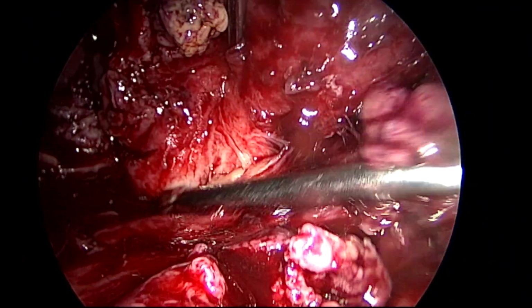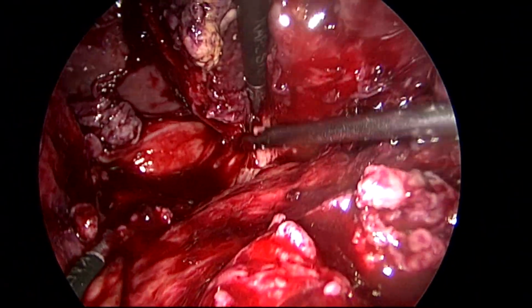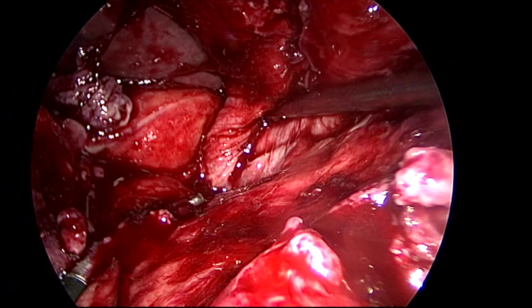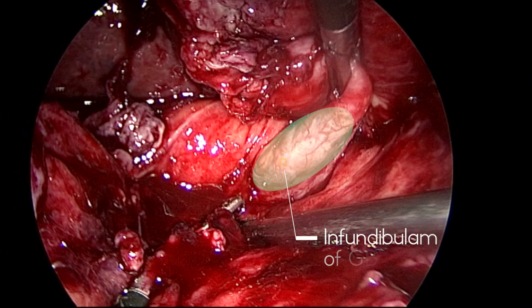Once I identify the infundibulum, I dissect anteriorly a little bit and then posteriorly, laterally. So I am able to lift the infundibulum. That is the infundibulum. Lift the infundibulum from the surrounding structure. I am holding the infundibulum now, and that is the infundibulum of the gallbladder.